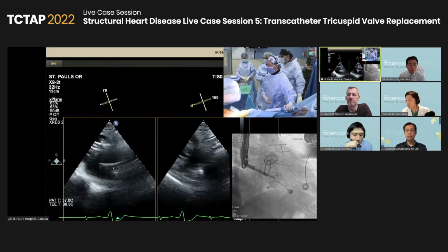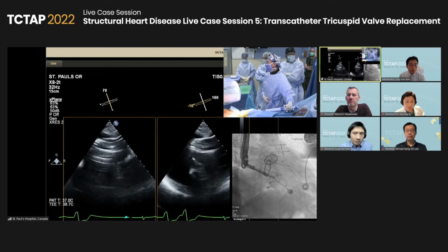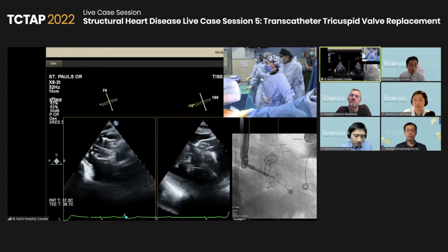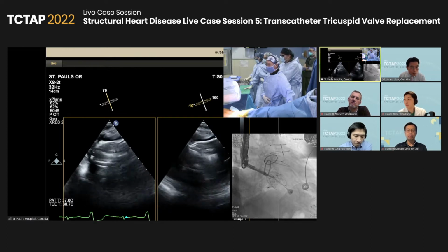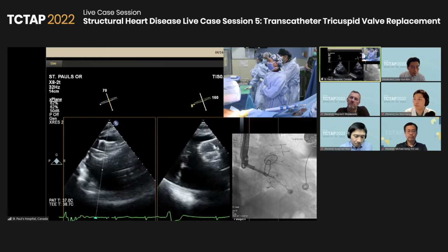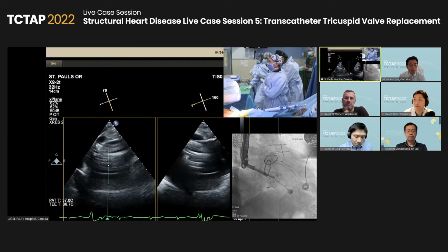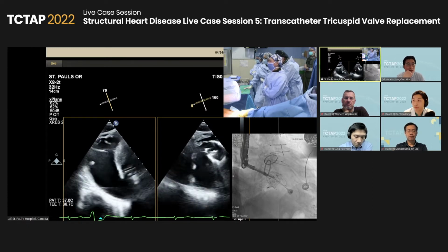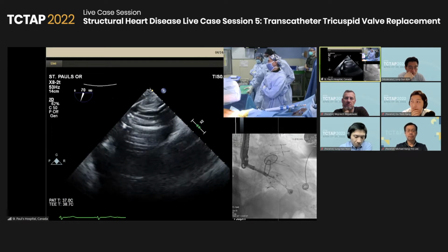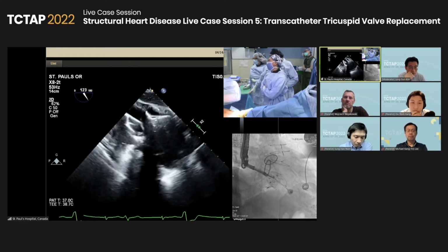Just going to see if I can. Yeah, so we're still trying to find a better image to show the septal tongue. We haven't done this before, but what about the transgastric line? Yeah, that's what I'm working on there. Is that not it there? So we try a different angle and technique for the fluoroscopy with the echo. Once we find that, actually, there we go. Okay, very good. That is such a good view.